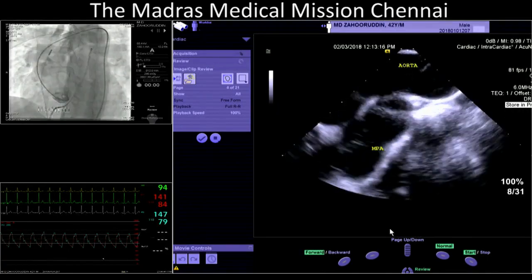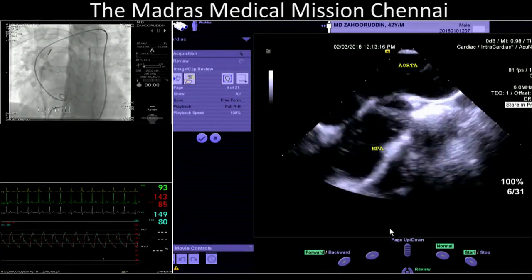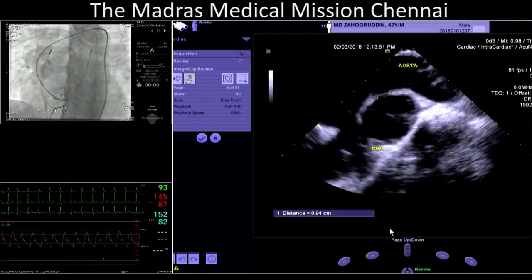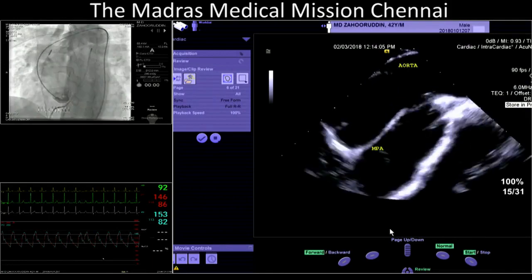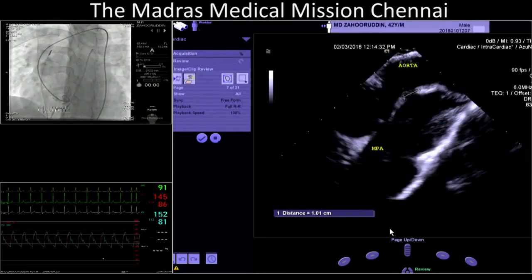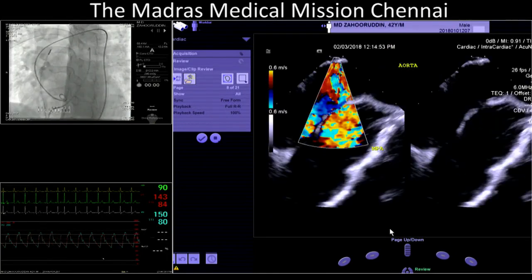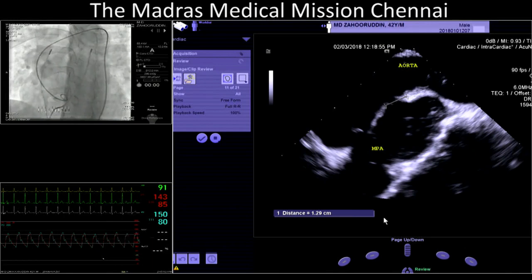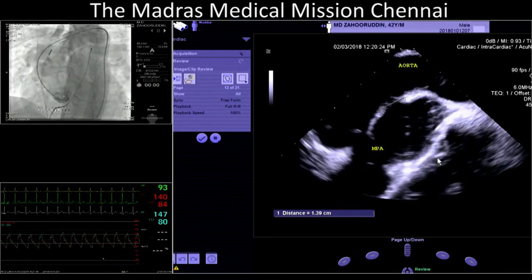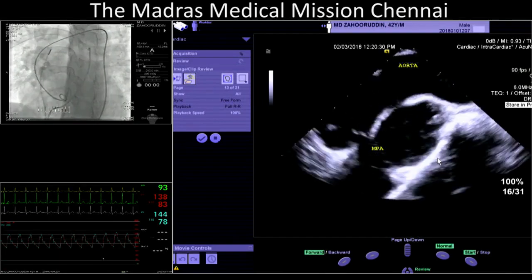We can see the window clearly. We will show the measurement now. So this is the window — it's even better seen here. Here it is measuring around 10 millimeters. And here we got around 12.5 millimeters. So it is coming to anywhere between 10 to 12 millimeters.